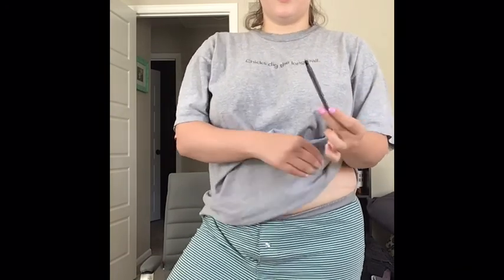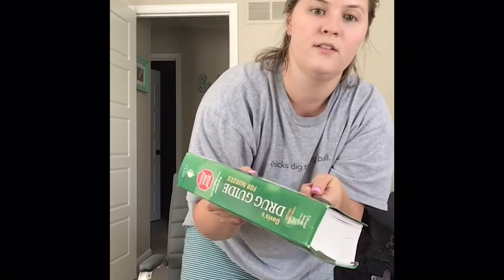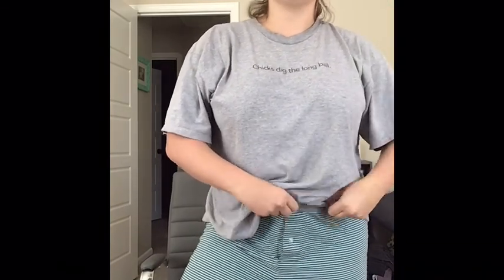So with insulin, you want to do your safety. So either you pull up, so if your safety is here, then you would want to take your needle on a hard surface. So like if your safety's here and this is your hard surface, you want to put your safety. So my needle is capped, and then put that in the sharps container, and then wherever your injection was, you would want to put a piece of gauze. And sometimes you could put a Band-Aid there. I mean, if it's insulin, they're probably not going to bleed. But if they do need something like gauze or a Band-Aid, then definitely put that there.